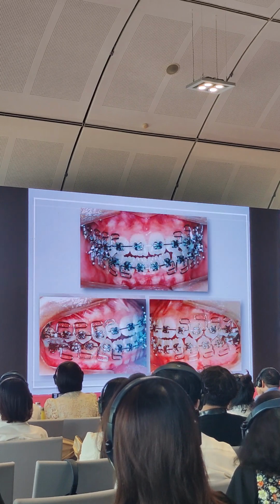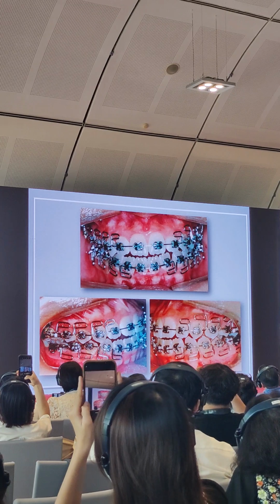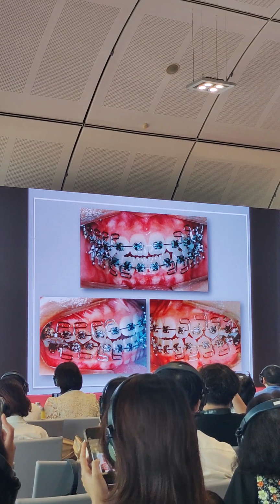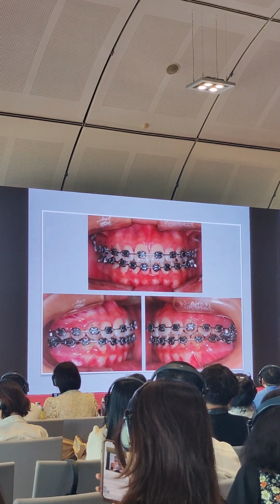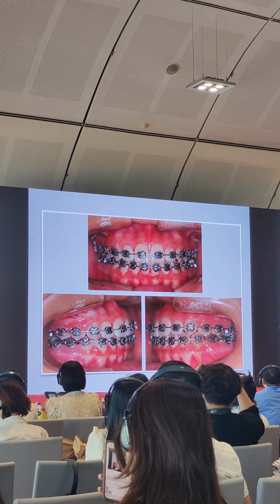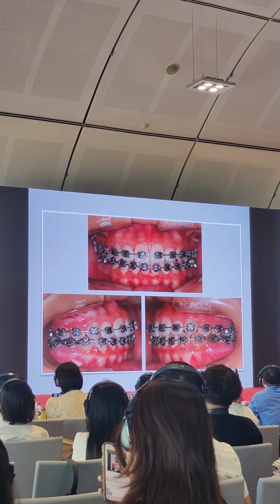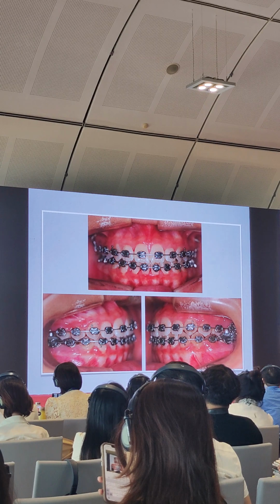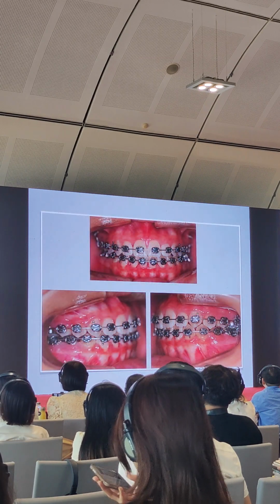So after that, the bite started to close, I just continued with my activation on my posterior segment, until I was able to close the bite, and then I removed my MEAW wire, and then I tried to correct the interdigitation. So just continue with it.